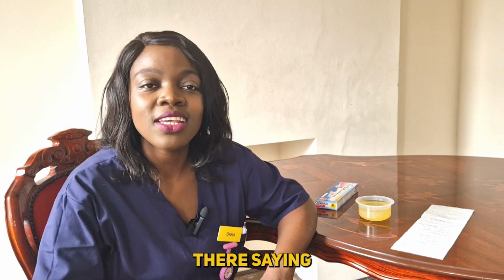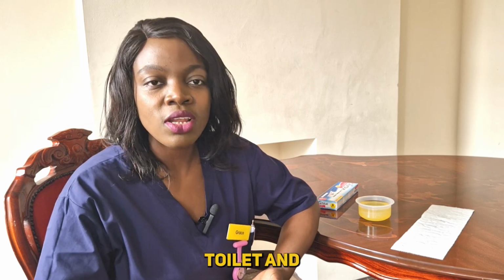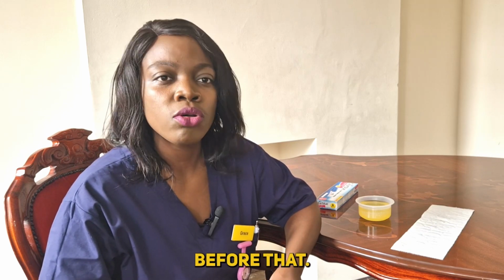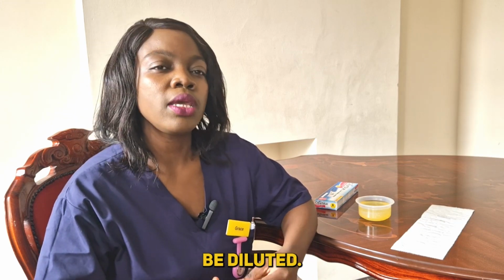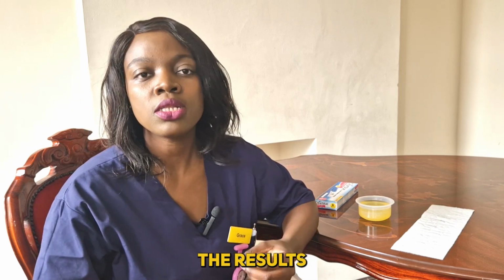Don't stay there saying that Nurse Grace told me to stay 3 hours for me to test positive. Don't do that, please. If you can't hold it, please just go to the toilet and release yourself. If you're able to hold it for up to 3 hours, then please hold it and avoid taking too much water before that, because if you do, it's going to be diluted, and if it's diluted, then there's a high possibility that you won't get the results that you want. So let it stay in the bladder for up to 3 hours.